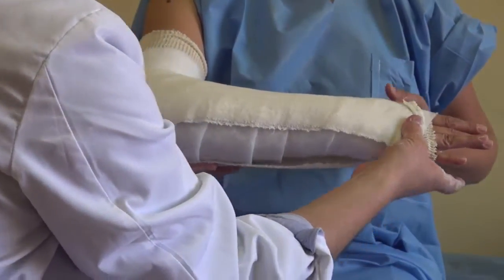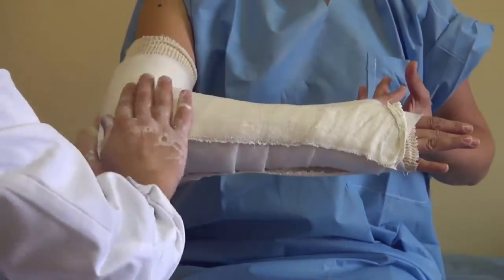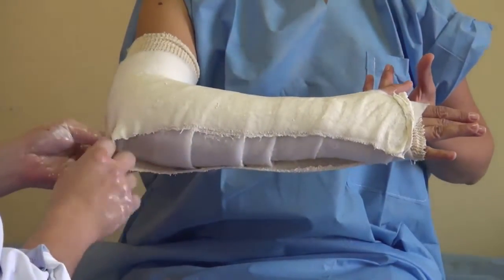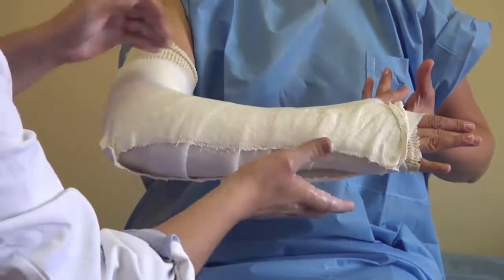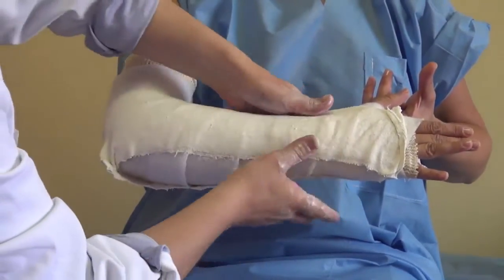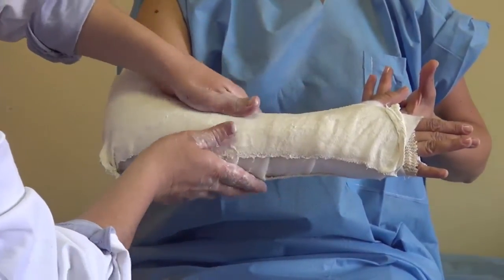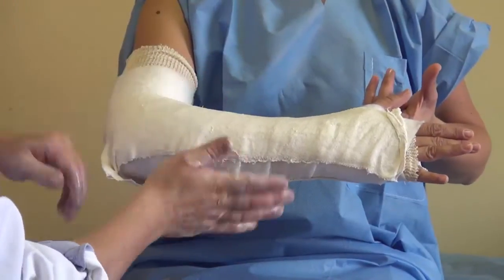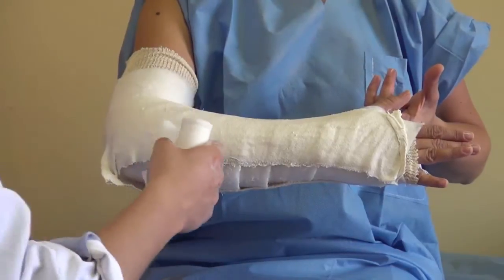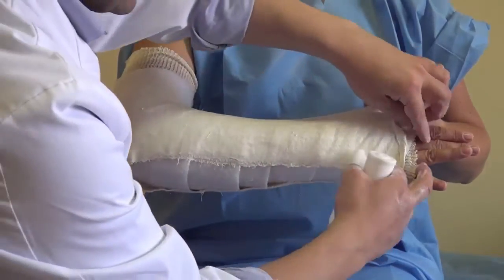With this kind of cast, you leave certain areas without cast in order to avoid compression problems due to edema. The water, as mentioned, doesn't have to be very hot — only a little warm or cold water is needed. You have time to do this; take your time to make a good cast.